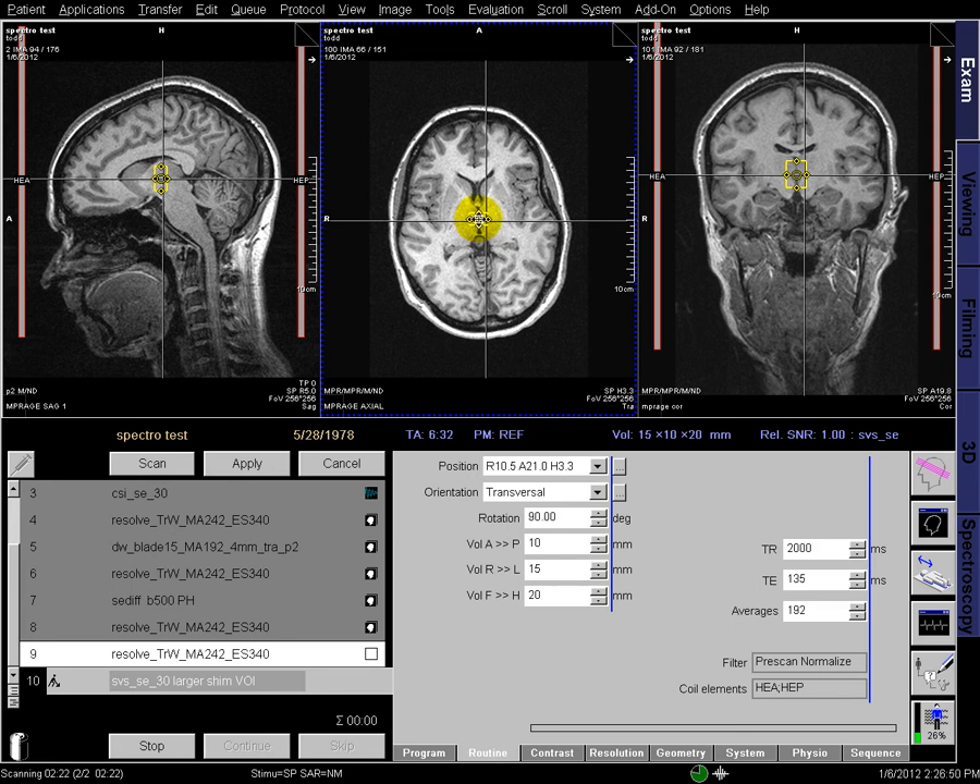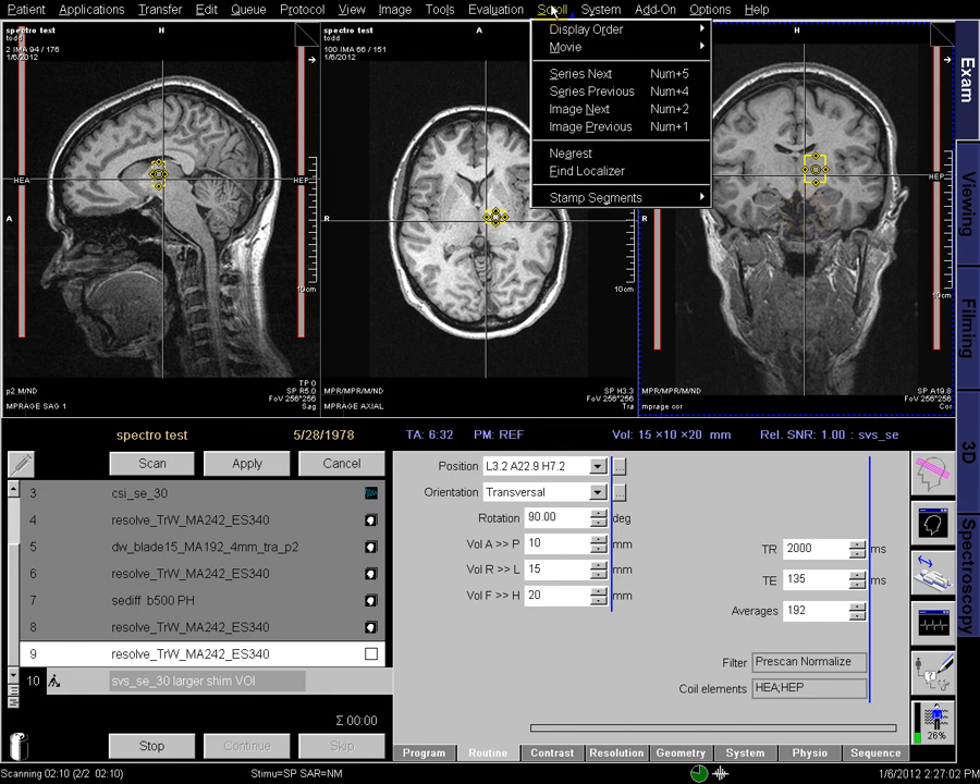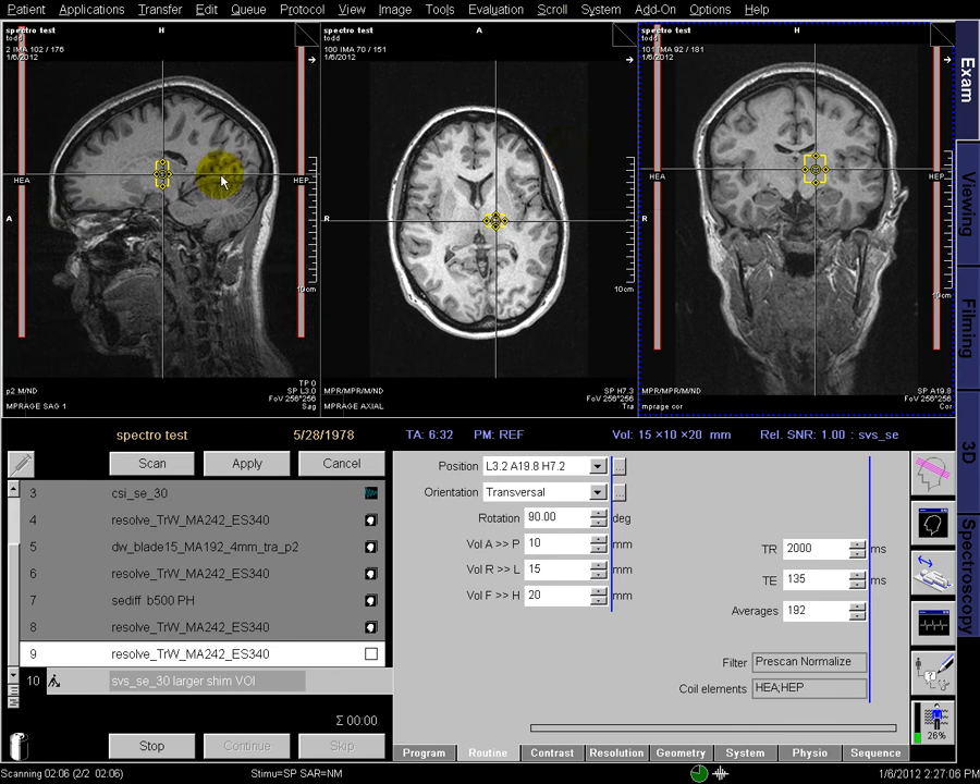Now let's move this over into the thalamus, up and around, and you can see on the three different images where it's located. If it's checkered, like in the left-hand sagittal one, it means it's out of the image plane. So you can go over to scroll nearest, and it'll move all the underlying images to the middle of that voxel so you can see where it's located.